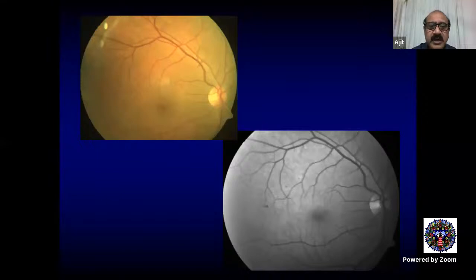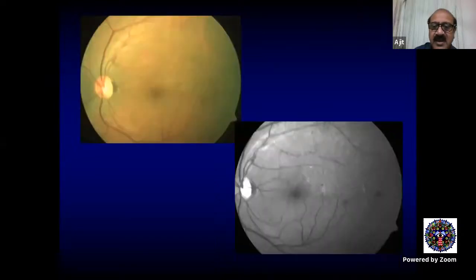Here I am showing one color photograph and a red-free photograph. Red-free photograph always delineates the lesions much better. I have a reason for this, which I will explain to you in a short while.